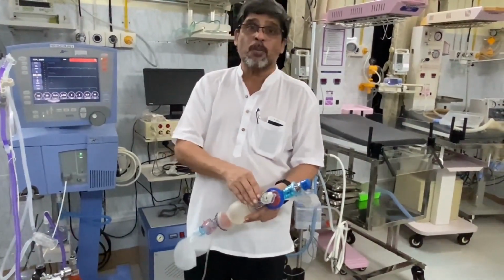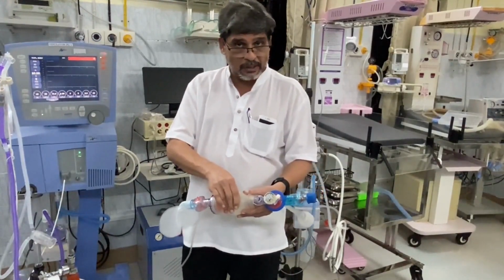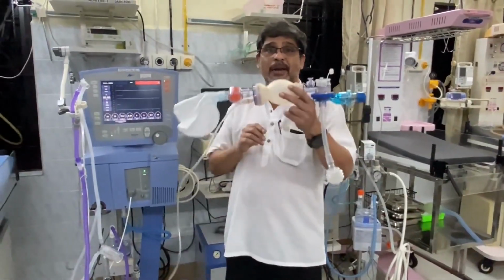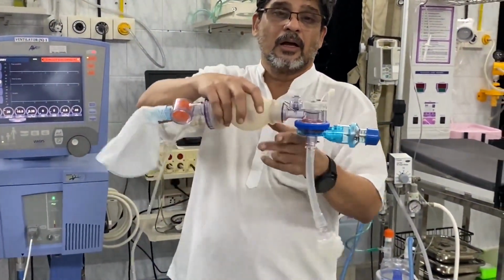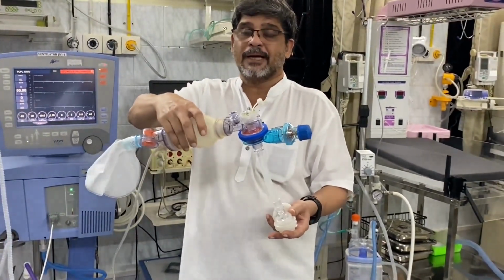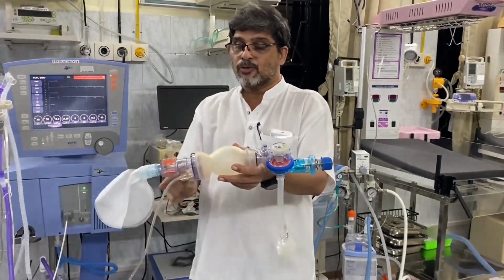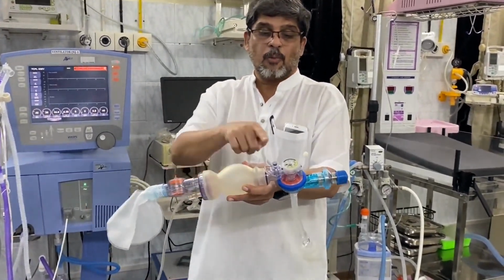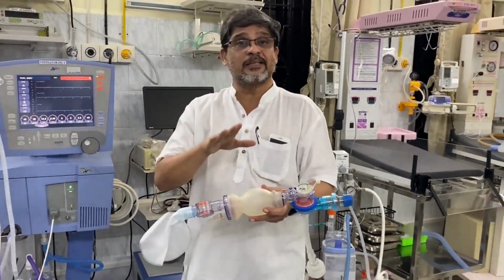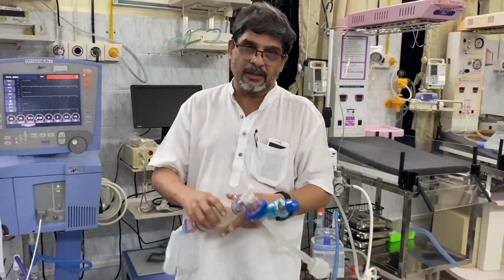So the same mechanism works in the baby. You set the limits for whatever you are doing, and you set the alarms to warn you. So a ventilator is nothing but this plain bag and mask. Inspiration, expiration, inspiratory time, expiratory time, peak inspiratory pressure, positive end-expiratory pressure, FiO2 through this, pop-off valve for protection, and sensors and alarms to warn you that you are exceeding the limits. That is as simple as that. That is the ventilator, nothing but bag and mask.